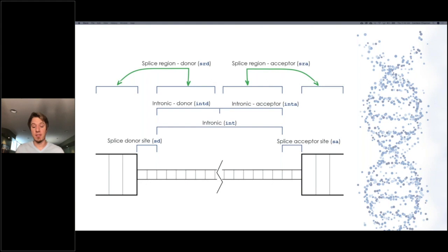However, for some introns, that can be a very broad category. You might search for a variant that's 4 base pairs into the intron on the splice acceptor side, and then we show you a paper that has a deletion over on the splice donor side that isn't nearly as relevant to you as you might like. And if there's only one or a few or even 15 results, it's really quick and easy to go through those in the Mastermind interface, as Rachel showed.